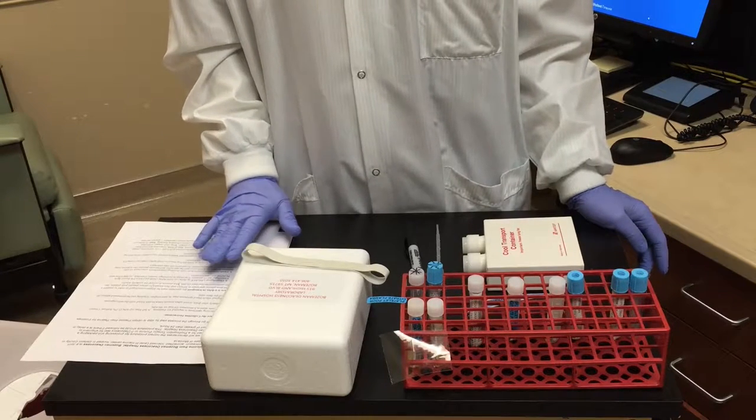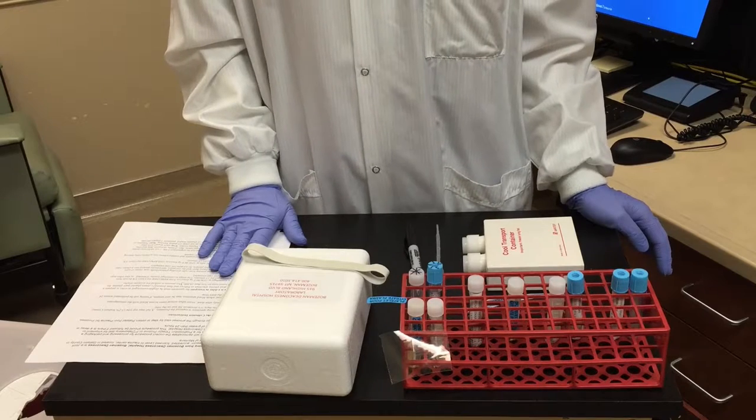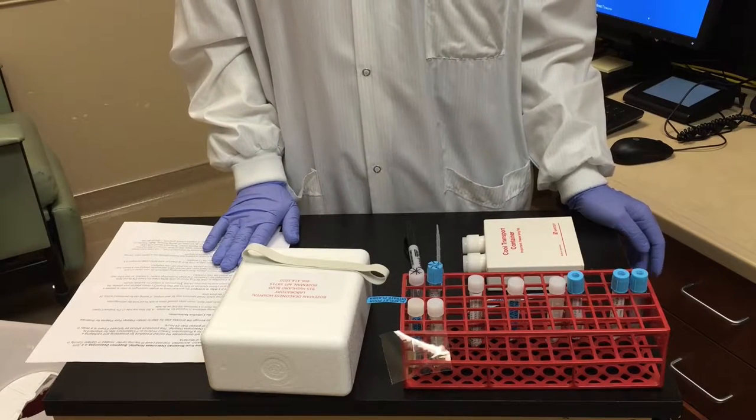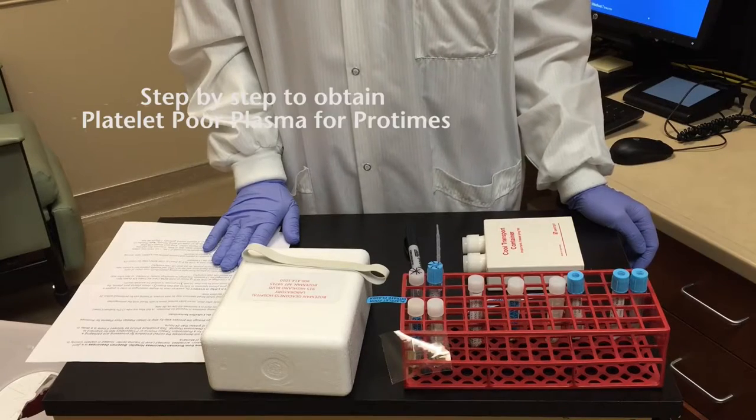This is a laboratory test for shipment to Bozeman Deaconess Hospital. This procedure should be followed if there is a delay in transport of greater than 24 hours.